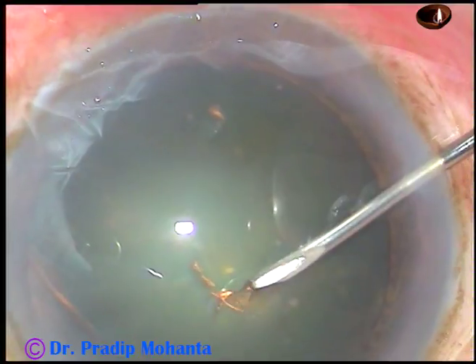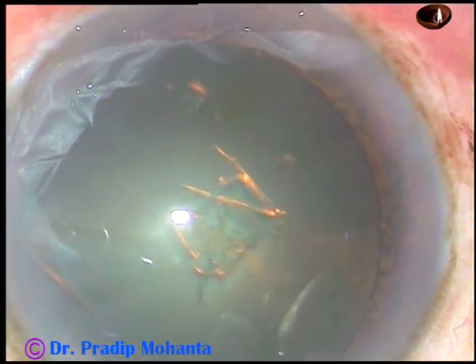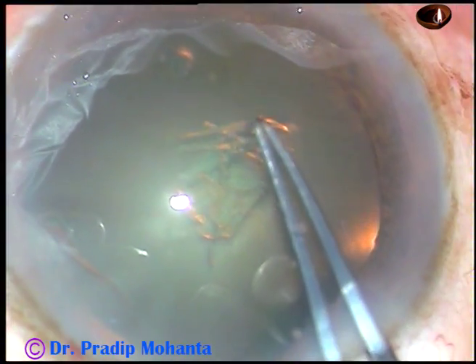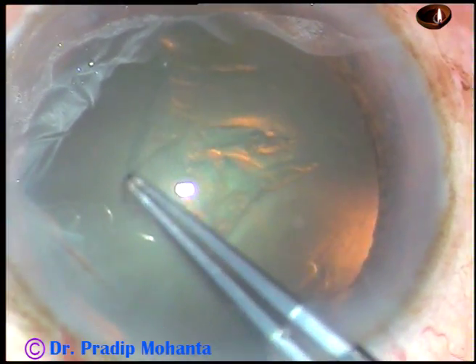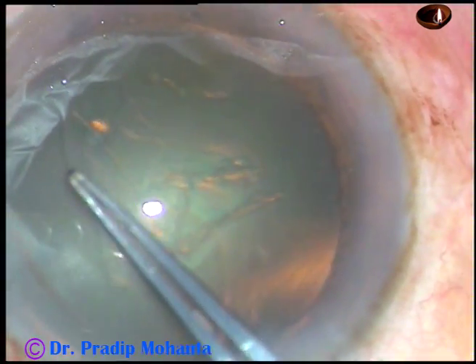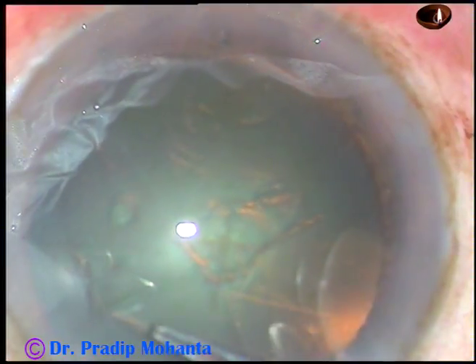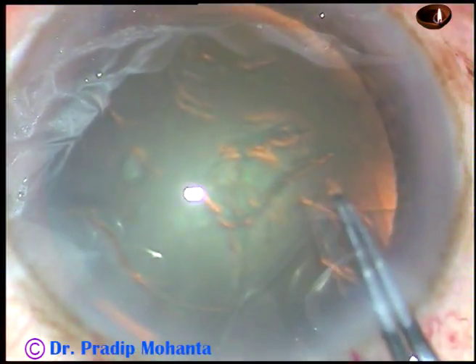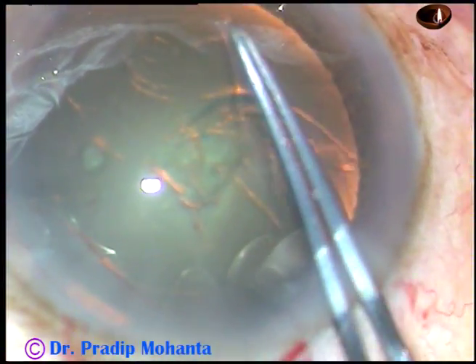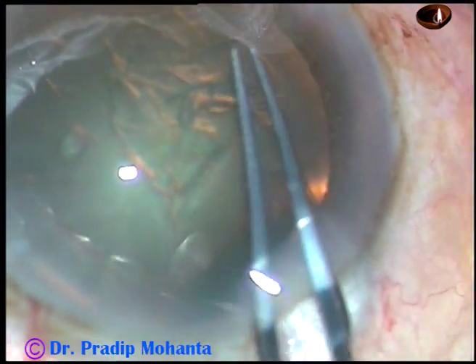This is capsulorhexis. The capsule is incised with a 26-gauge bent needle and then Utrata forceps is taken. I hold this capsular tag and go anti-clockwise all around, remaining at a certain equal distance from the margin of the dilated pupil, and thus I manage to get a round rhexis. This is not a femtorrhexis but it is a fairly acceptable round rhexis.